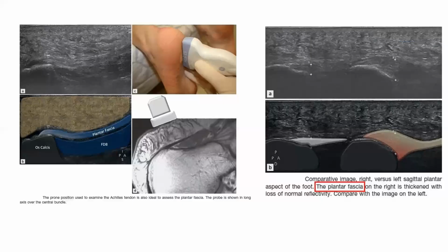Sir, I want to know about PRP, just one session or should we do a second? And what is the volume of PRP? I usually go not more than 3 ml. Inside the tendon, I usually go 1 to 1.5 ml. If you are injecting above and below the tendon also, 1 ml above the tendon, 1 ml below the tendon, and within the tendon, 1 to 1.5 ml is more than enough. We cannot inject more than 1.5 ml inside the tendon.